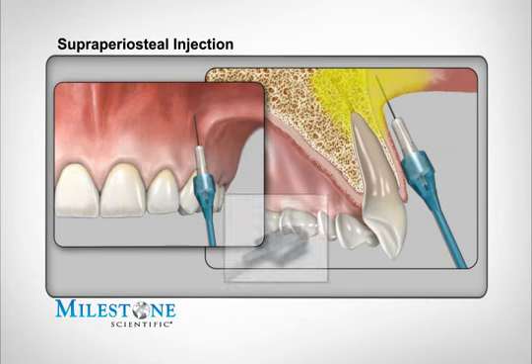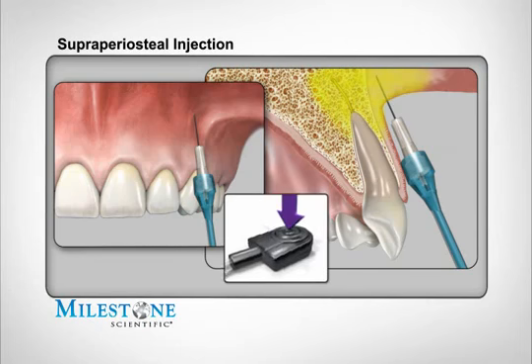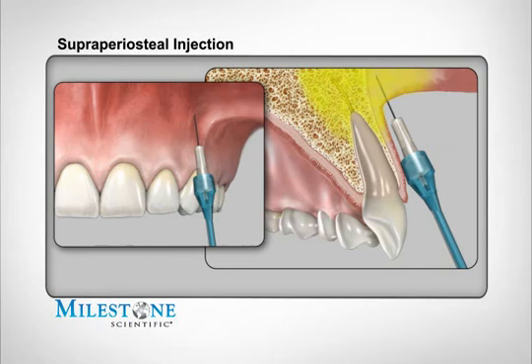To enter into the rapid flow rate, depress the foot control pedal beyond the halfway down position. This will allow you to enter into the second, more rapid flow rate in which you can administer the remaining amount of anesthetic solution. This should only be used after your patient indicates that effective soft tissue anesthesia has occurred. When you've delivered the required dosage, you can remove the needle.